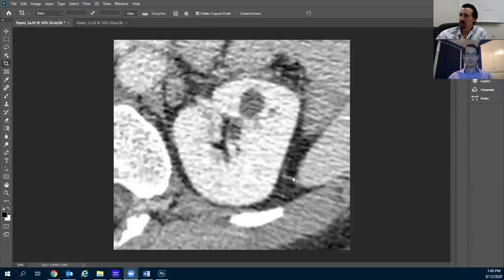I'm just going to show the audience what we're talking about when we discuss masses that are part of your study. This is an example of a typical mass we might encounter at portal venous phase CT. The mass is homogeneous. If we were to drop a region of interest measurement on it, it might come back as 27 Hounsfield units, and we might be left wondering: do we need to send it to an MRI to characterize it? I think your study gets to this exact question.